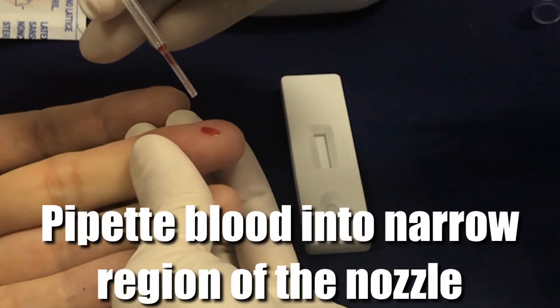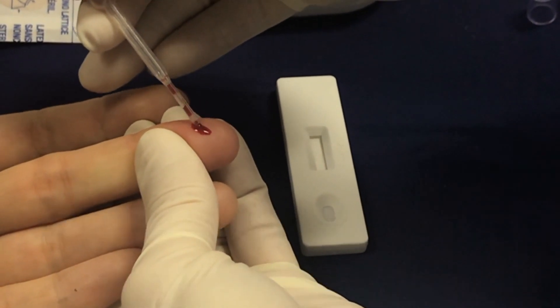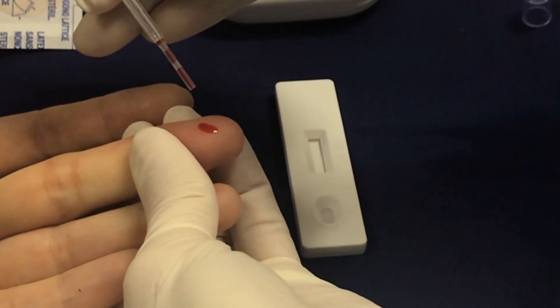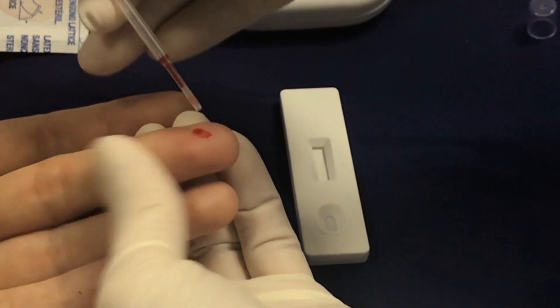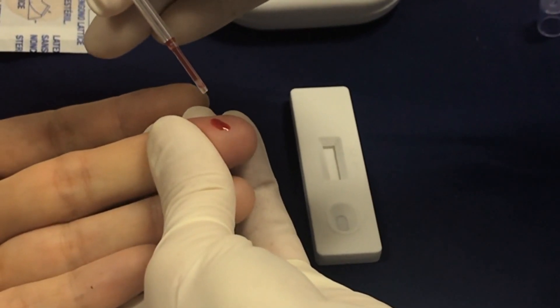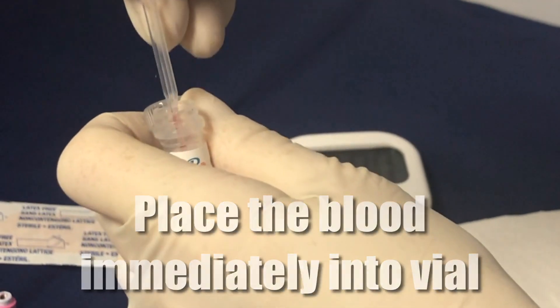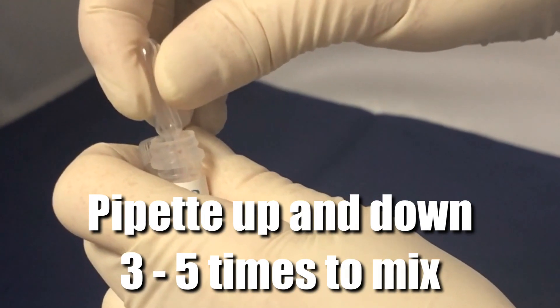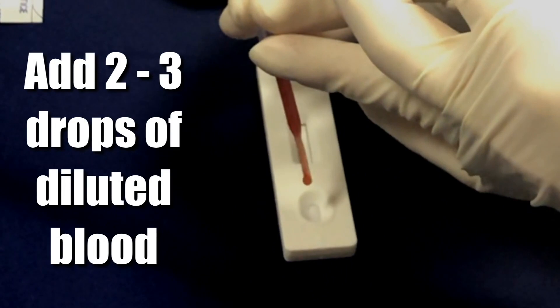Once a good drop of blood has formed on the finger, use the plastic pipette to fill the narrow part of the pipette with blood. Try to avoid forming bubbles to ensure that the amount of blood collected is correct. Serum can also be used during this step. Immediately place the blood into the vial of sample diluent and squeeze the pipette bulb three to five times to mix well. Then add two to three drops of the diluted blood to the detection cassette.